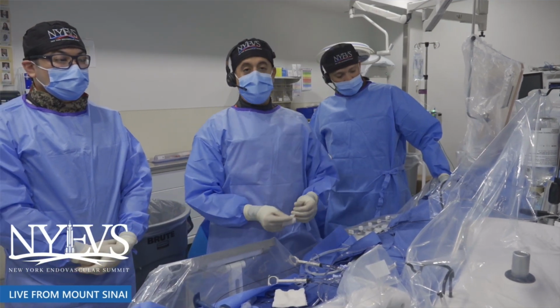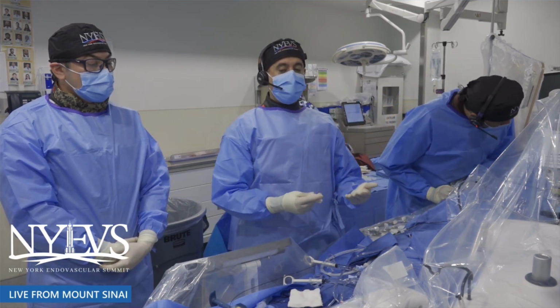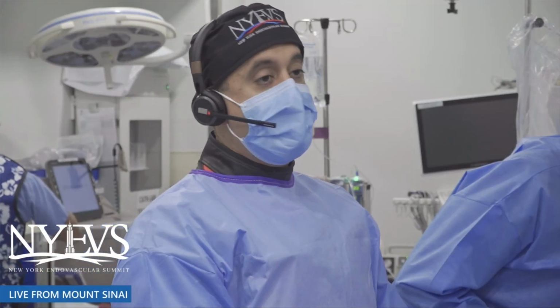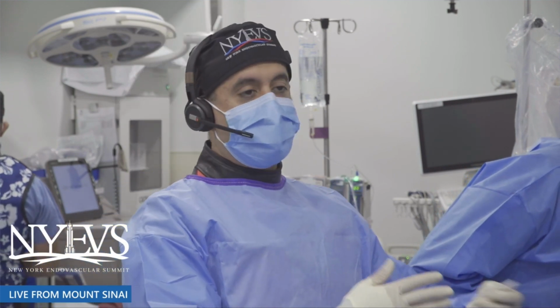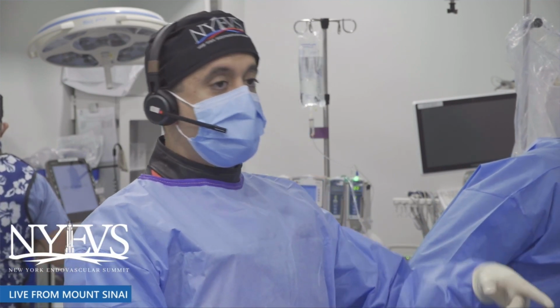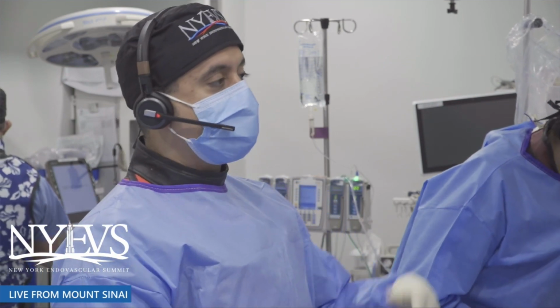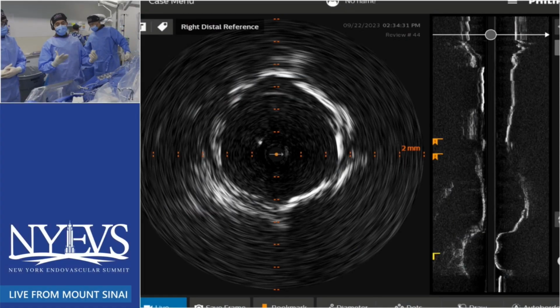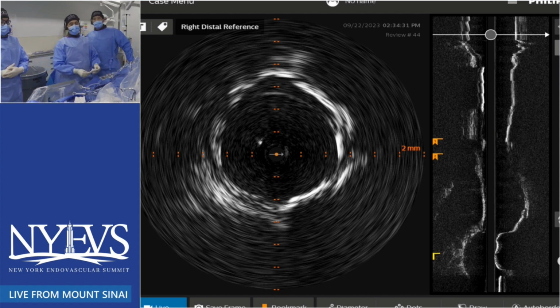I agree with Karthik. The reason we presented the case is the amount of discussion we have. You know how people have a knee-jerk reaction to do shockwave as soon as they see some iliac calcium, because it's becoming more in fashion, and also the reflex of putting in a covered stent. But the panel had a great discussion covering everything from no shockwave to covered to non-covered, straight up balloon expandable. We'll show you the IVUS and you'll see how angiography can underestimate. We read tram track calcification and get scared, but we can also miss calcium by not doing IVUS. Again, IVUS gives us an extra set of eyes and helps us make a decision.